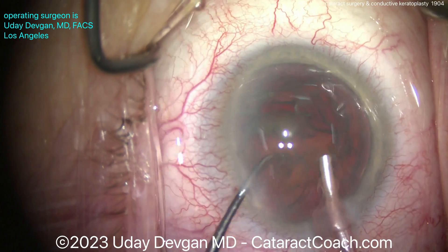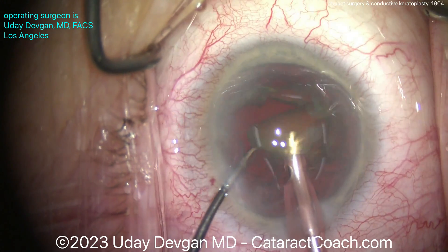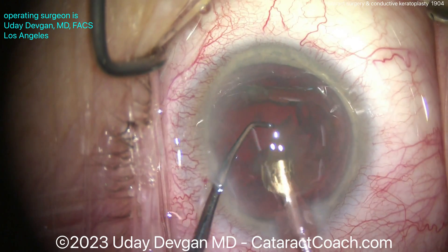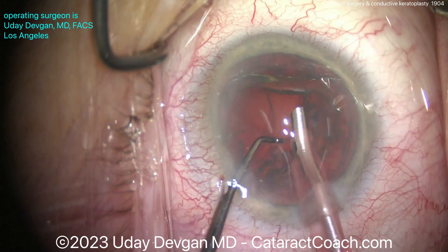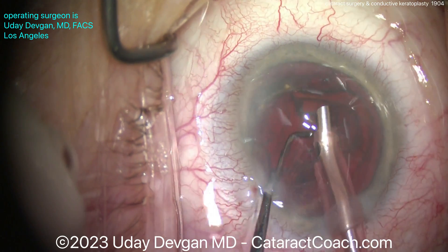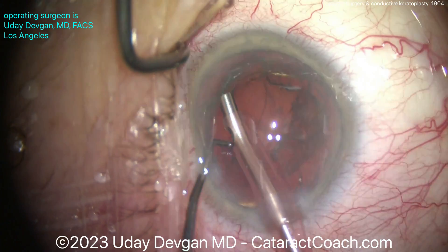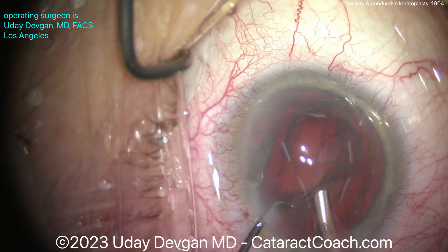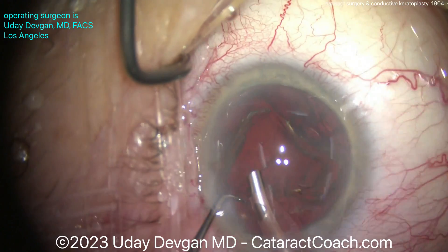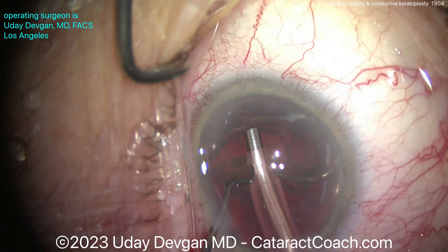So as a result, what do you do for lens calculations here? First, you want to use a formula that takes into account anterior chamber depth. You don't want to use an older formula like Holladay 1, Hoffer Q, or SRK/T, because those don't require the anterior chamber depth — they assume ACD based on the keratometry measurements and axial length. Use a more modern formula like Barrett or Haigis, which actually require you to input a measured anterior chamber depth, so corneal power is not used to estimate ACD.